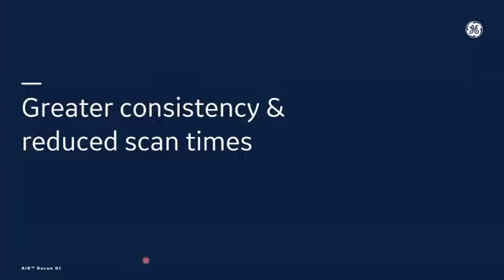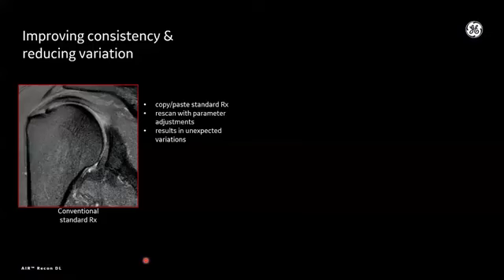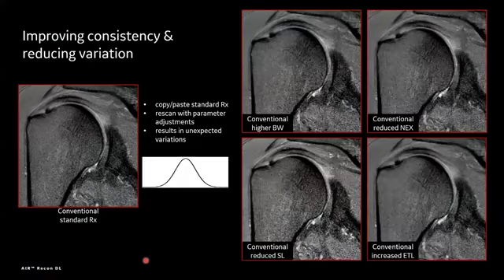Okay, so that said, let's talk about consistency and scan times. When we got AIR Recon DL and were doing a lot of volunteer scans, we wanted to measure, well, just how can I break it? What can I do with the parameters and with the protocols?